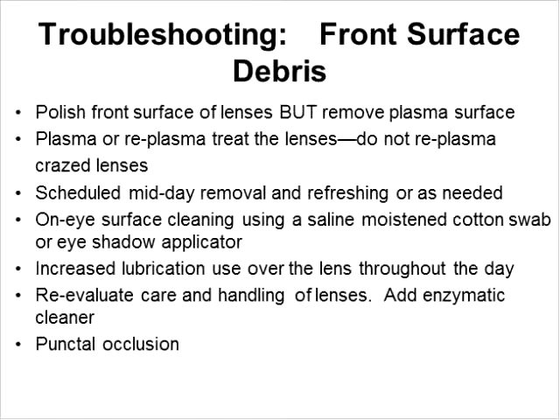You could discuss with your patient scheduled midday removal and refreshing, or as needed. We have what's called the squeegee technique, where we moisten a cotton swab with either saline or their artificial tears, and instead of removing the device, they actually leave it on the eye and swab the front surface, and they're able to identify an object across the room and see if they've gotten all the debris off.